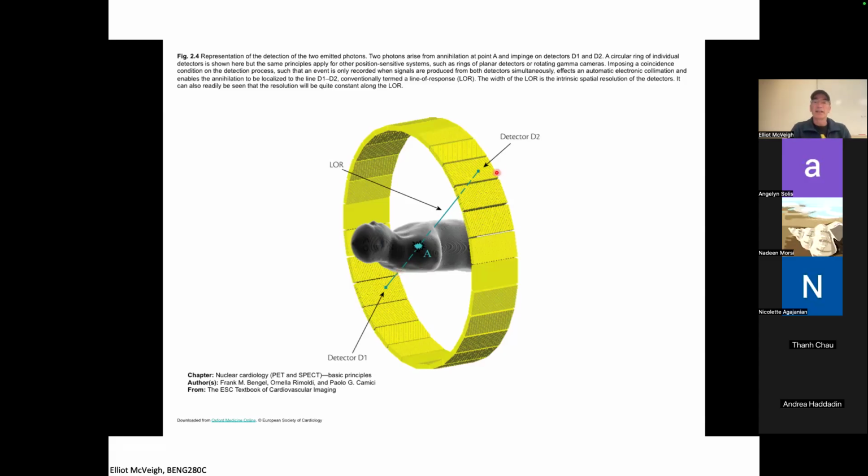So we can build these detectors such that they work really fast, and we don't have to put a grid over the top to get the resolution in the theta direction, right? So as you can imagine, if we get thousands of these per second, we can build up a very large list of these lines, right? So you just have to have the two detectors on either side and just list them out as this all happens, right? And then we just keep making that list.